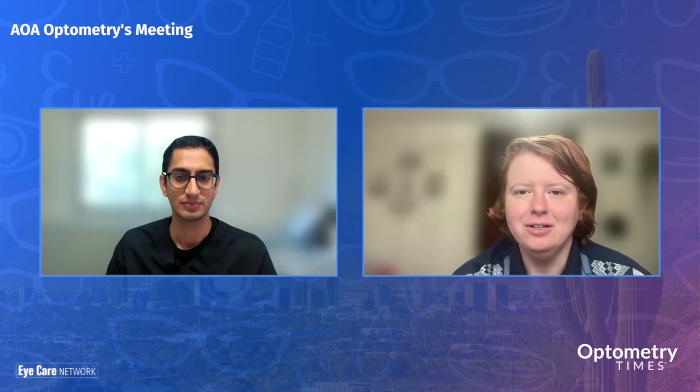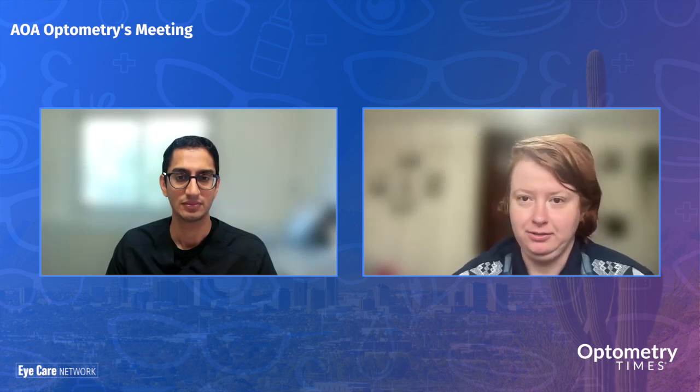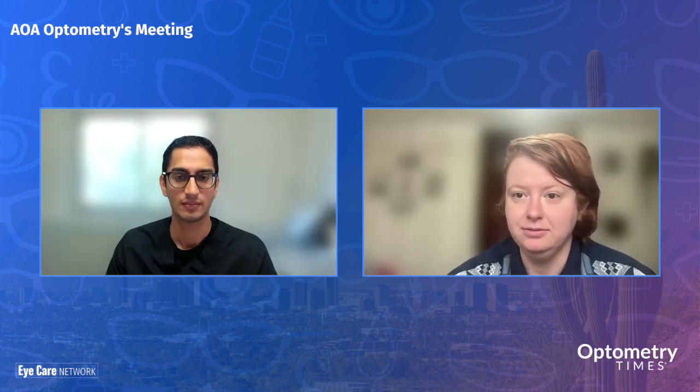So, how are advances in OCT technology specifically changing our ability to detect retinal disease earlier? It's a game changer. I remember when I went to school, OCT was TD, or time domain. Now you're thinking to yourself, what's time domain OCT? Just imagine an 8-bit, the original Nintendo from back in the day. That's what the scans kind of looked like, so you couldn't make out real detail at that point.